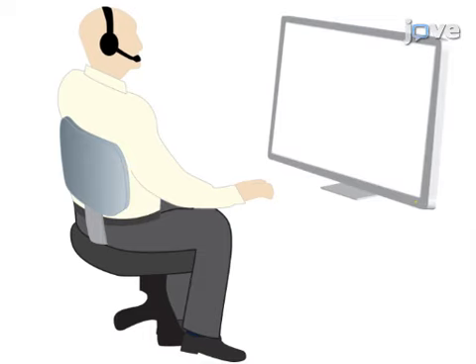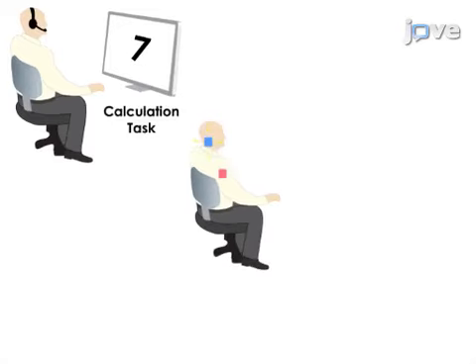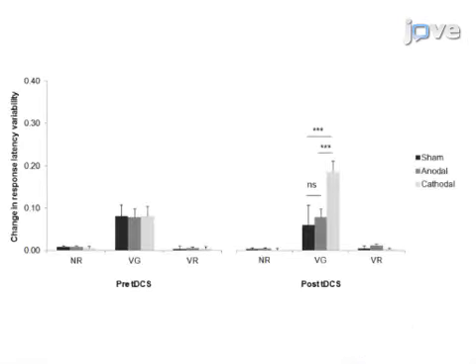The final step is to process and analyze the data from each task and compare performance pre- and post-cerebellar tDCS. Ultimately, cathodal transcranial direct current stimulation over the cerebellum is used to show how cognitive functions can be facilitated when tasks are difficult rather than easy.